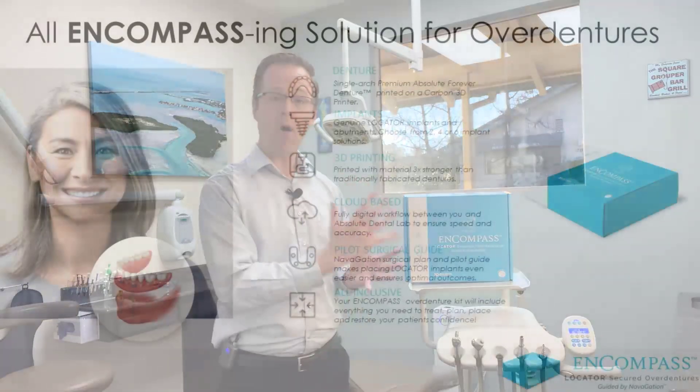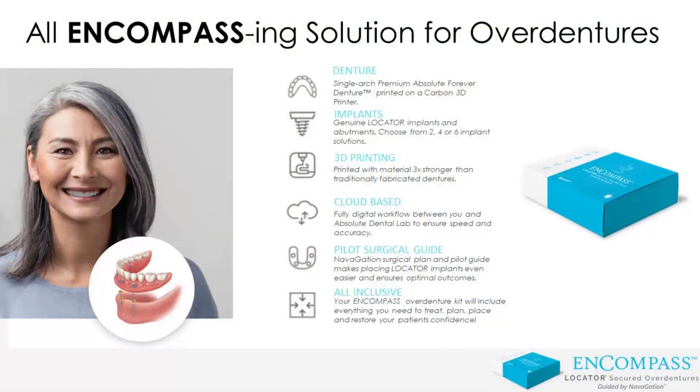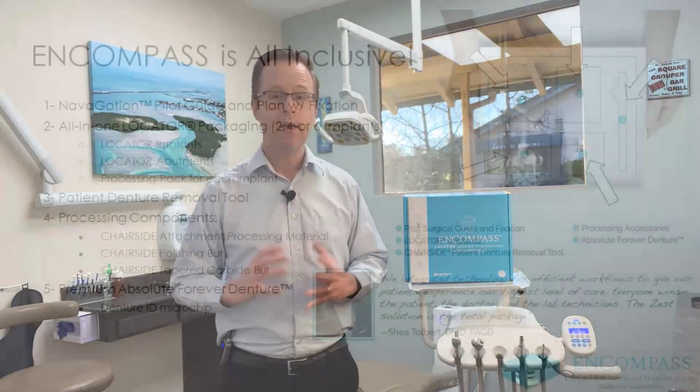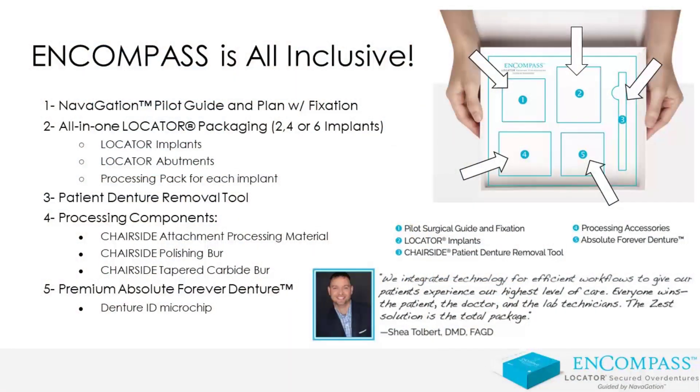Encompass is just that — it is an all-in-one package specifically for clinicians that are really interested in taking their digital implant overdenture journey to the next level. By being able to use Encompass, we have the option as clinicians to work together with a team, both from a 3D treatment planning as well as a 3D design perspective. The Encompass solution is an all-in-one box solution that comes to me as a clinician with the aid of our 3D navigation treatment planning and our Absolute Denture team, allowing us to create a seamless experience.